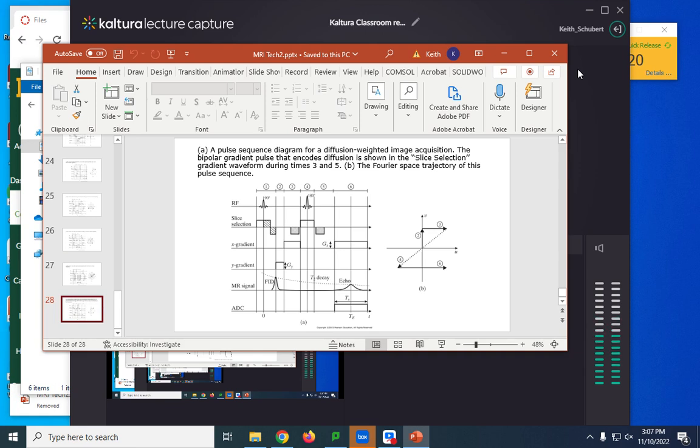It just takes a Fourier transform, because the IFFT is basically the same thing, just a weighted version. So it's basically a Fourier transform and you get your image. Now I can do a 2D one, basically one per slice, and you're done.